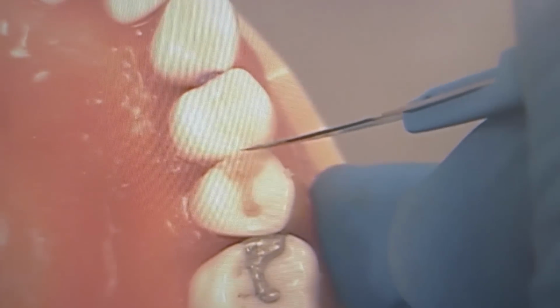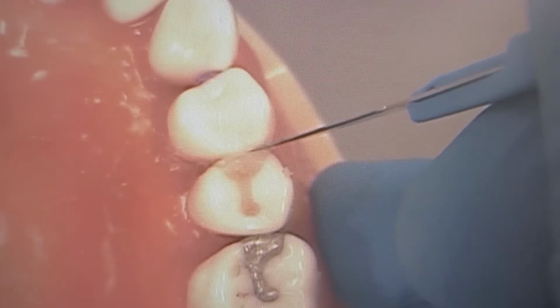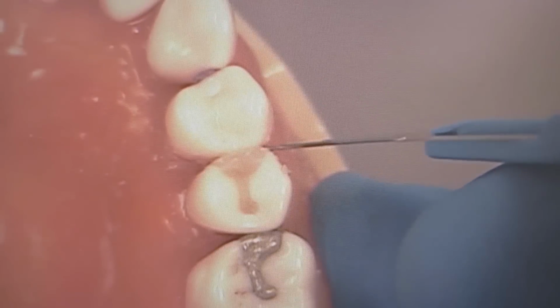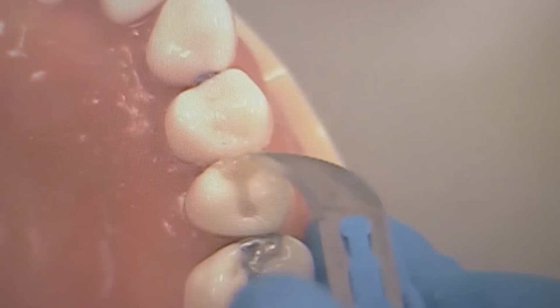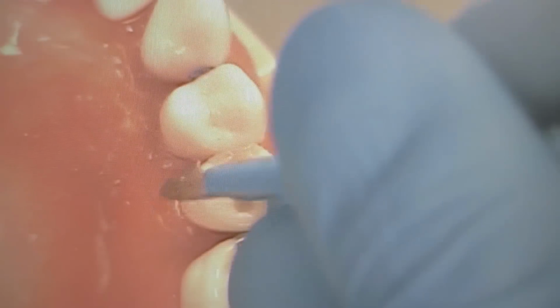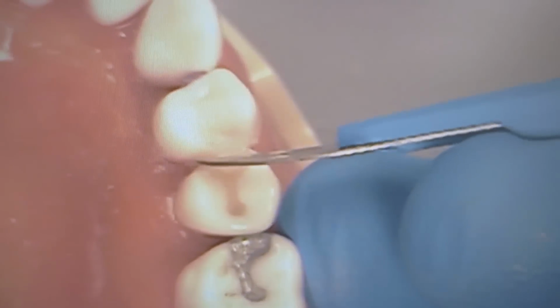If I place my 12 blade in this orientation, I will always get an exact margin. So in order to adapt it, I'm going to bend it backwards to this one. That way I can pull it back, because you're just going to spread it. You're spreading your teeth apart. Remember the wedge is just going to expand in place. You're angling the blade to create a rounder margin, right? Just so I can engage the bevel on the tooth. That's because you want to adapt more, right? Exactly.